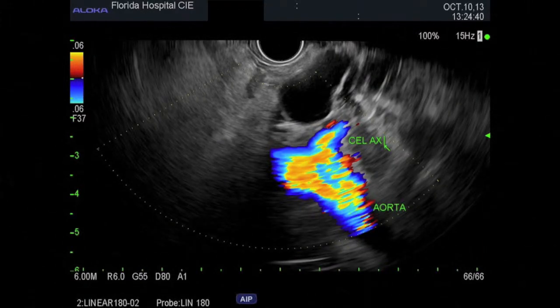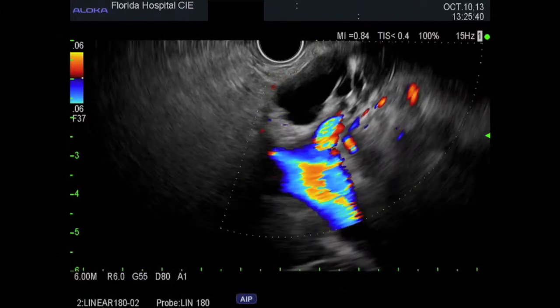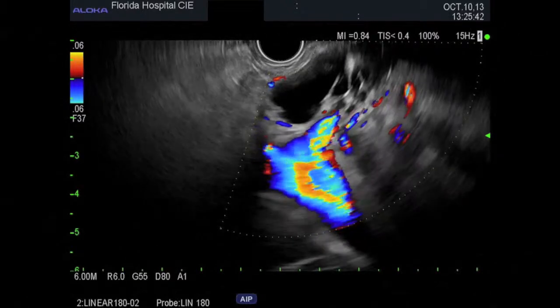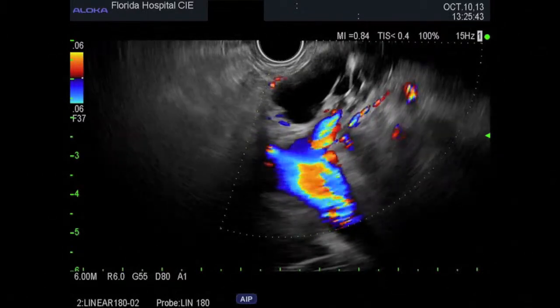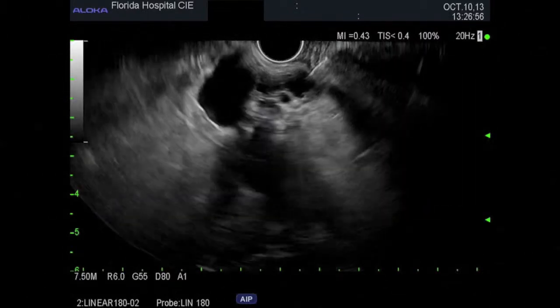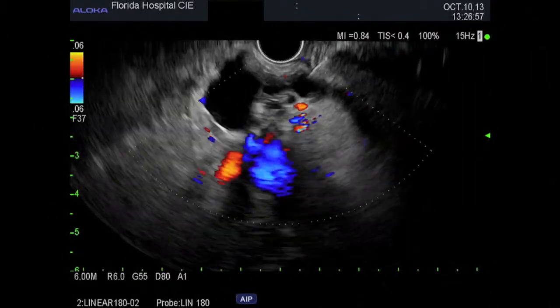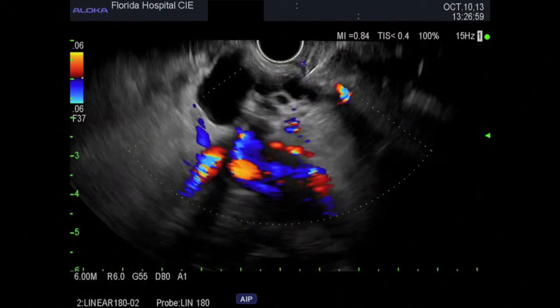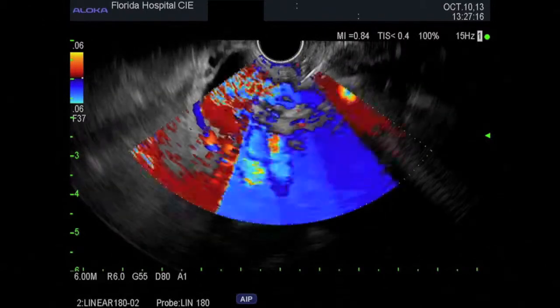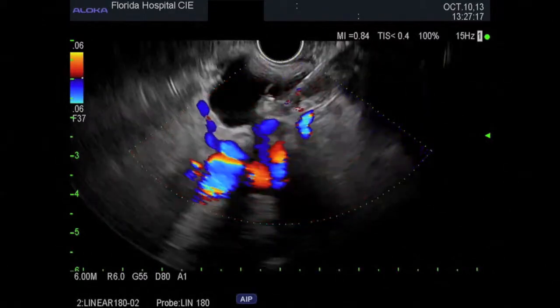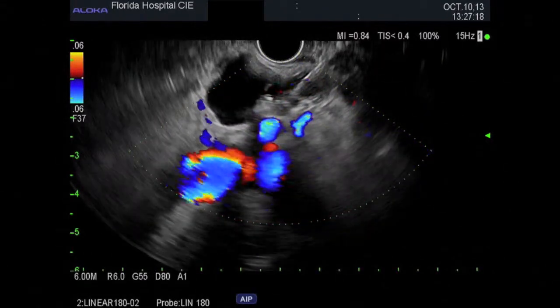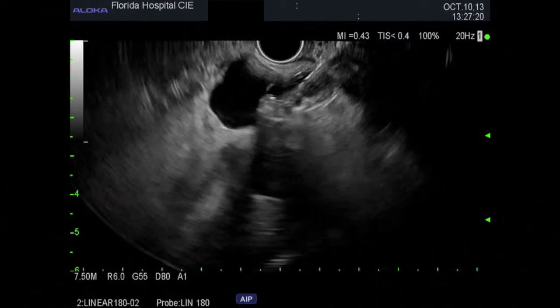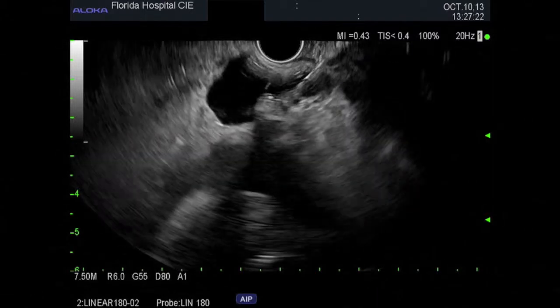The celiac trunk was best visualised from the afferent jejunal limb. In this position the aorta is viewed from a caudal-cranial angle and slopes down from left to right. This is opposite to the view obtained with normal anatomy when imaging the celiac axis from the upper lesser gastric curve.